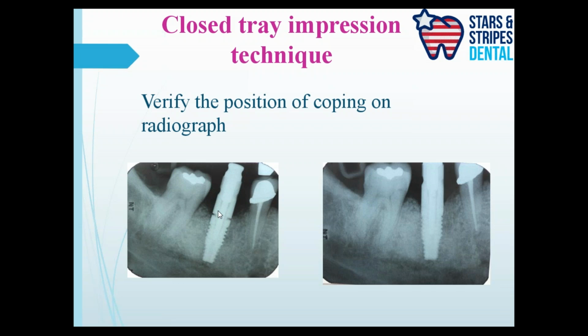So now you're creating a macro junction, not the micro junction, a huge gap at the junction between implant and crown. And we all know we don't like open margins, correct? Even when we do crown and bridge preparation, when we put crowns on the teeth, we don't like to leave open margins. And why? Because marginal leakage happens.